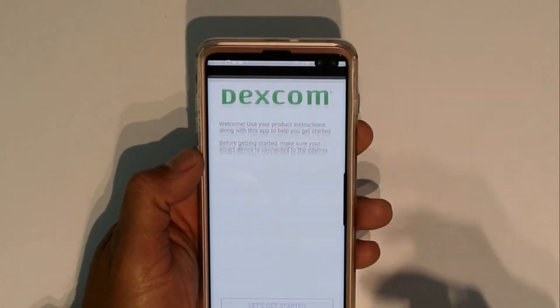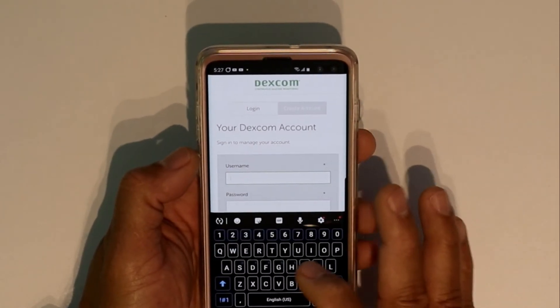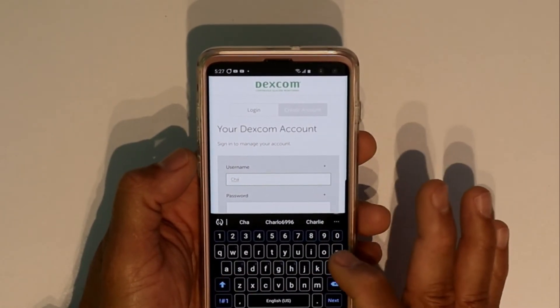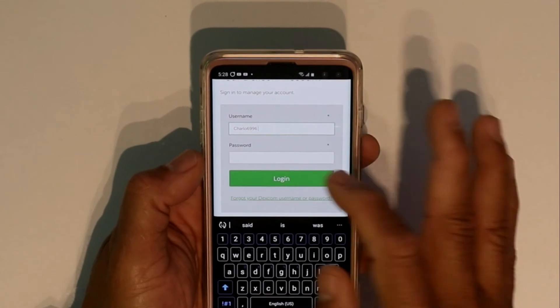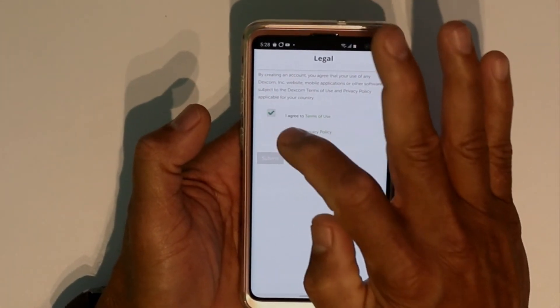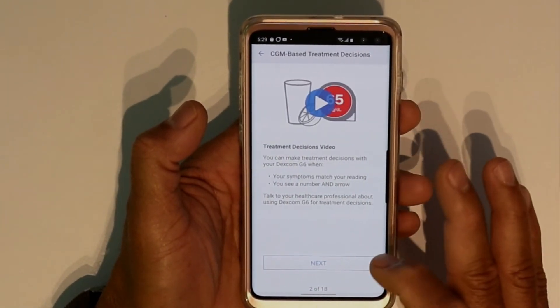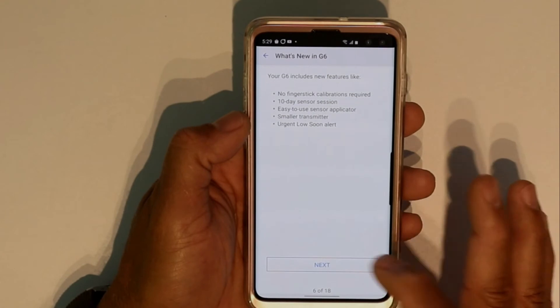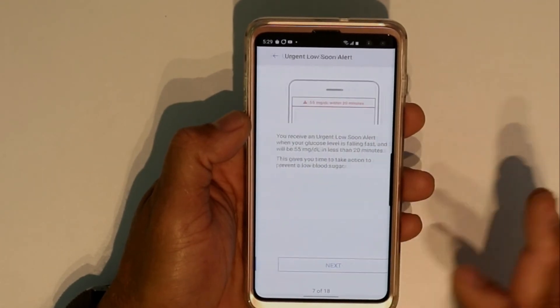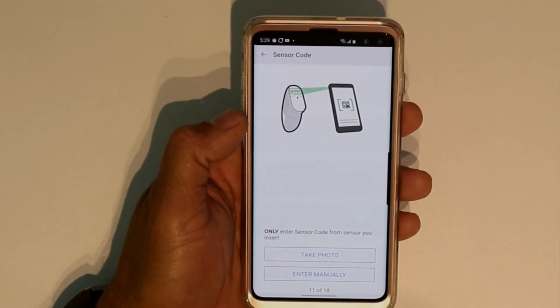You're going to open the app and it's going to ask you to get started. Put in your login information and your password — if you haven't got one, you'll need to create one. Agree to the terms and just click next through the prompts. You want to import settings so this app will do whatever the real app would do. Keep clicking next through the setup.